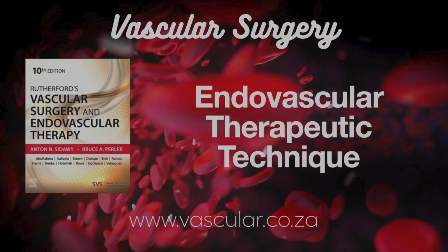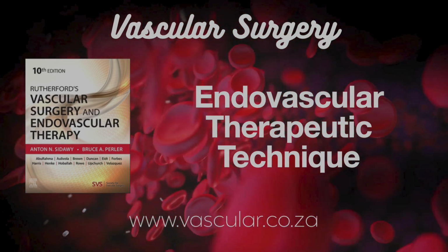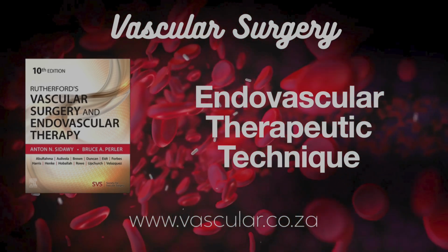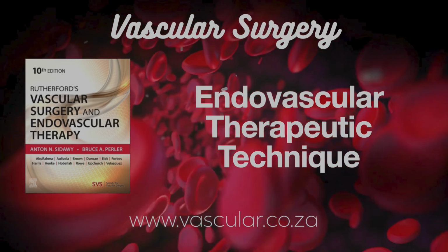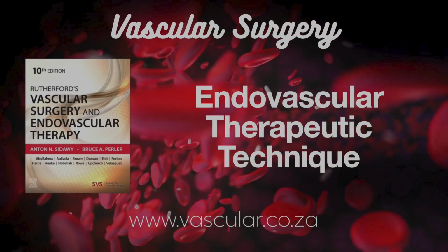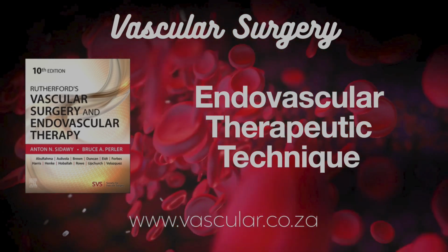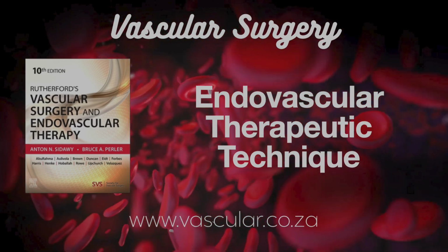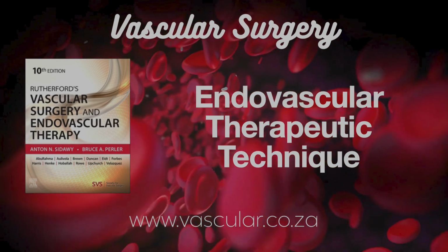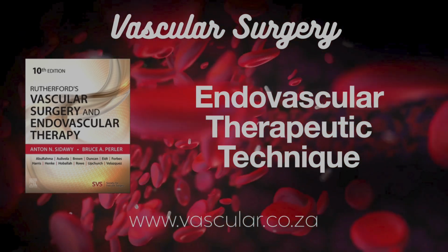And implanting a self-expanding stent. Key differences. SES are flexible, good for long lesions. Size 1 to 2 millimeters larger than the reference vessel. It can't expand beyond its stated size. Predilate the lesion. The SES is in a covering sheath, so less dislodgement risk during delivery. Deploy by slowly retracting the covering sheath under fluoro. Watch for the jump forward. Most aren't repositionable, except the Wallstent. Must post-dilate the SES with a balloon after deployment to ensure full expansion and apposition.